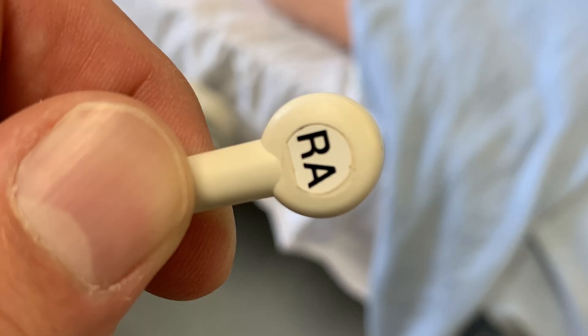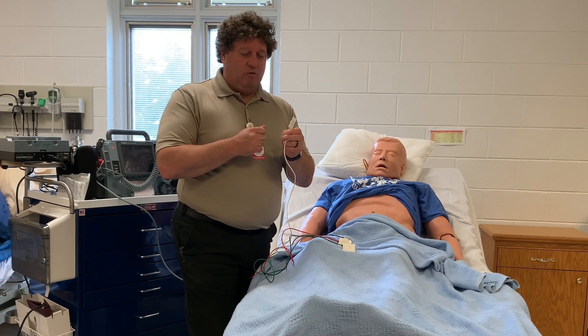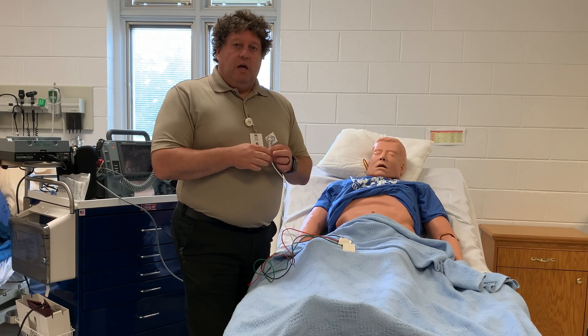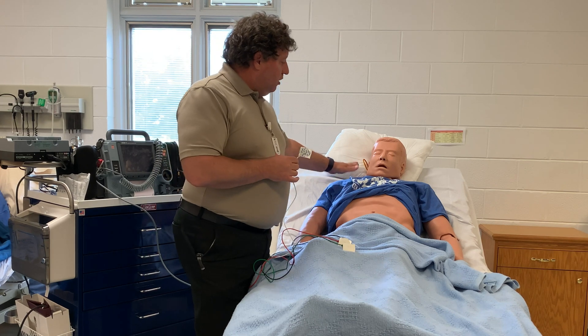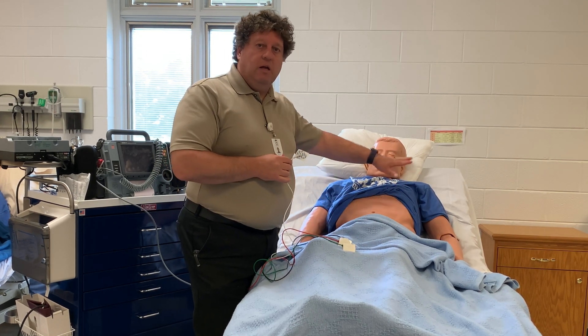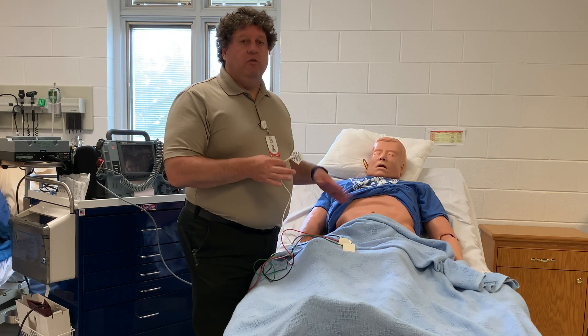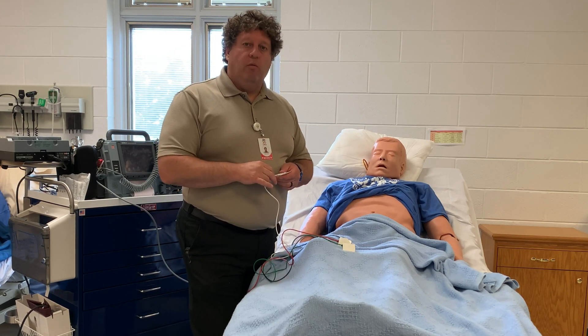You can also look at the leads — this one has RA for right arm — so you can always look and see which one goes where. In this area, many people will say salt, pepper, ketchup, relish as a way to remember the placement around the body. You just have to remember that salt is right. It never really worked for me, but it's just another way to remember where they go.